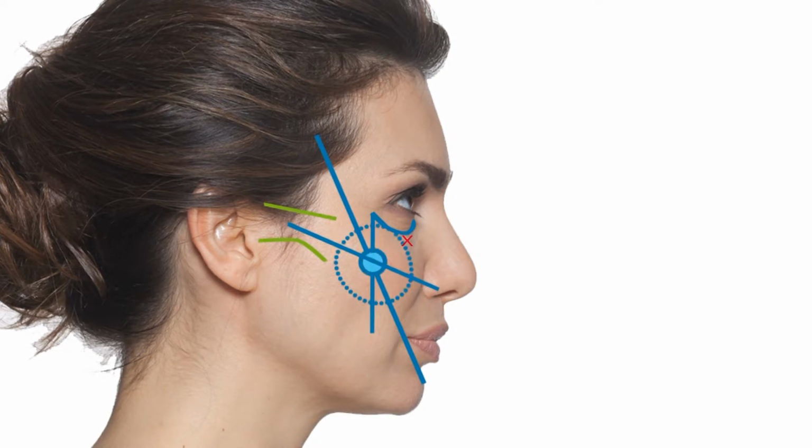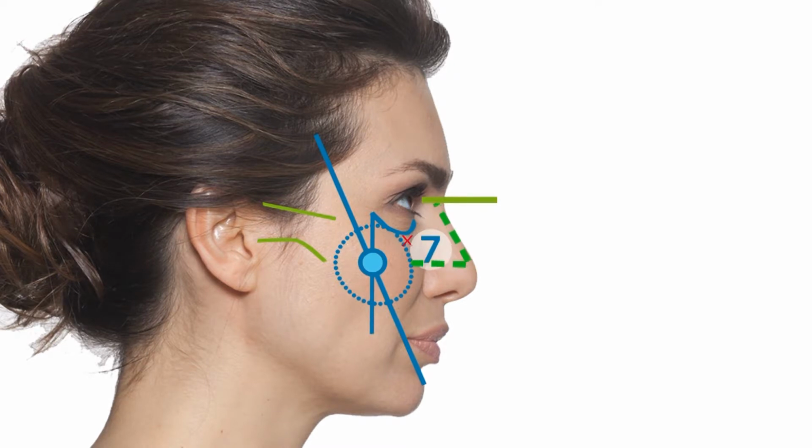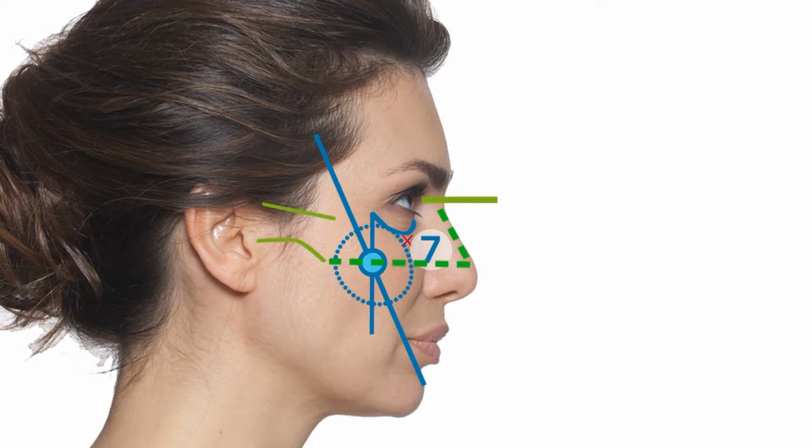How to check the cheek apex? Technique 2. 7. Draw a transverse line that is 2/3 inferior to the nasal radix. This line should intersect your prior markings at the apex of the cheek in most patients.